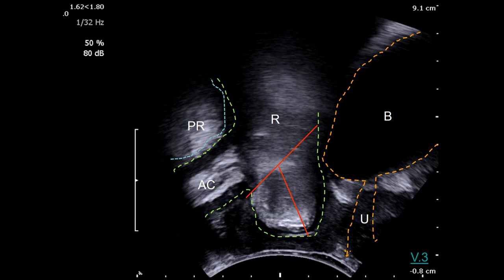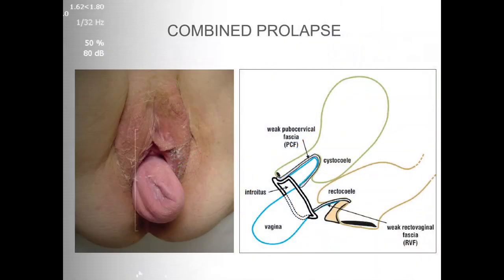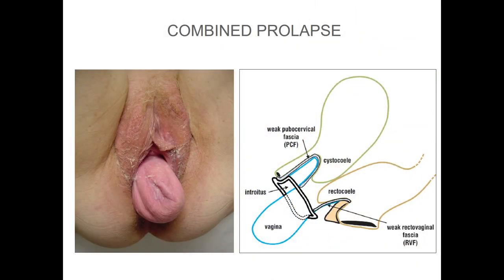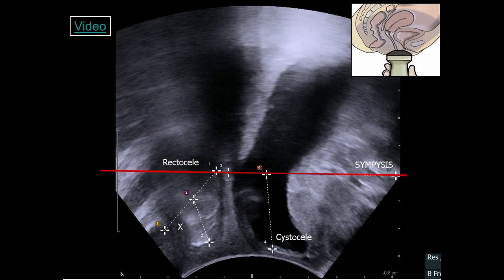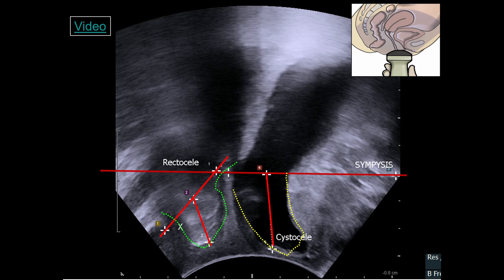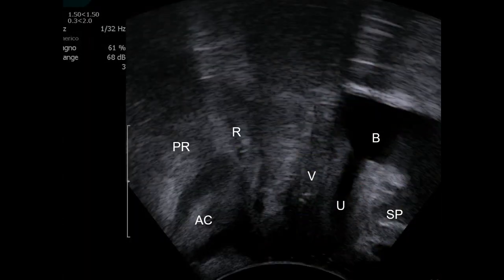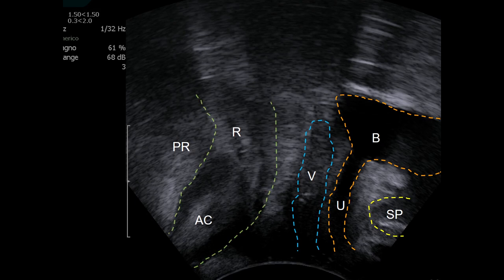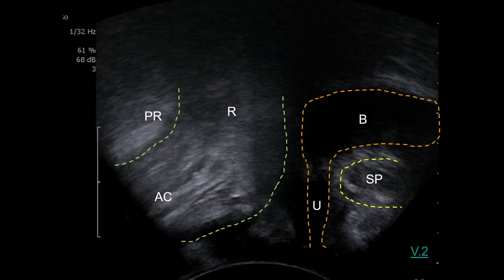It is very important for the surgeon to know if the rectal sac is functional or not. If there is stool trapping, it is a rectal sac that is connected to outlet obstruction. You can have a combined prolapse — you see the prolapse but don't know what is inside. In this patient we can see bladder and rectum — multi-compartmental. You need to treat in the same operation: ask your urogynecologist to fix the bladder, and I fix the rectum. Rectal prolapse can be visualized as an enlargement of the rectal diameter. If this diameter becomes double compared to rest during Valsalva, this is a diagnosis of internal intussusception or rectal prolapse.